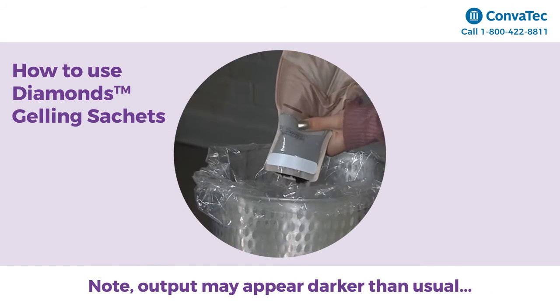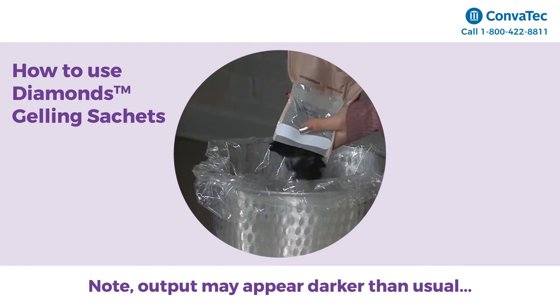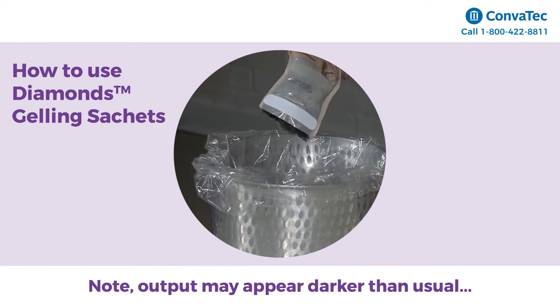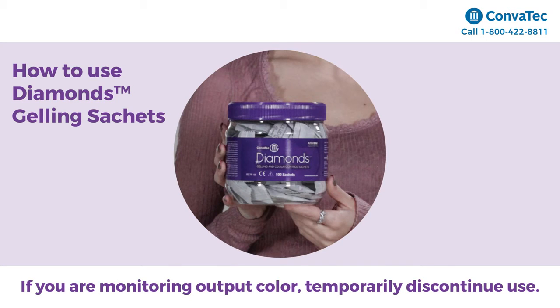Note: output may appear darker than usual and/or may contain black flecks as a result of the Activeone odor control system. If you are currently monitoring output color, temporarily discontinue use of Diamond's products.